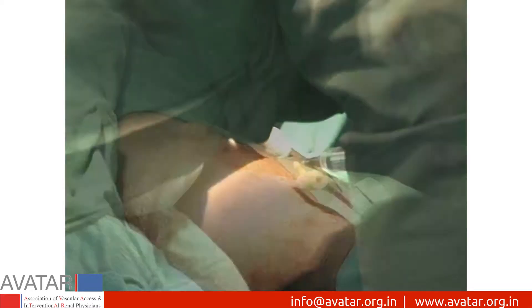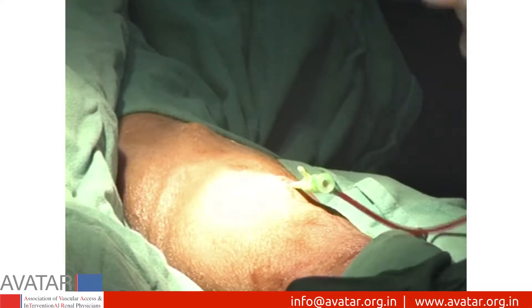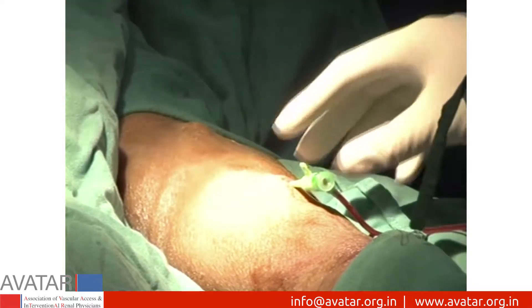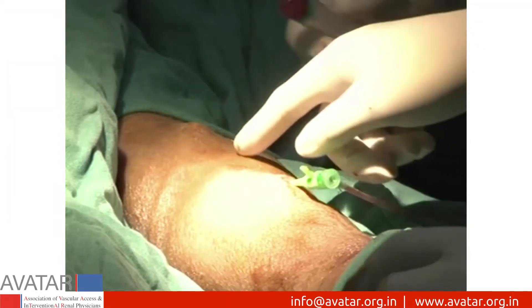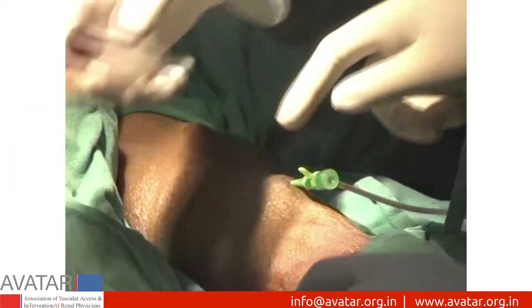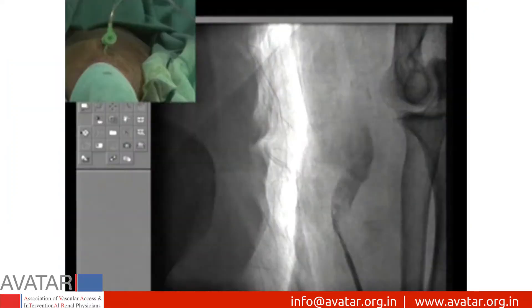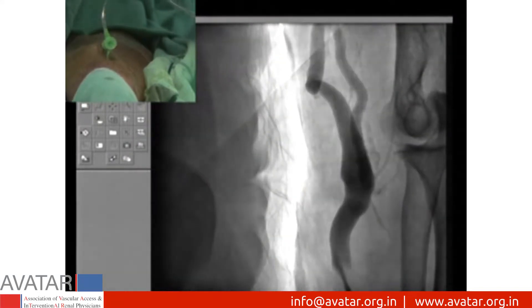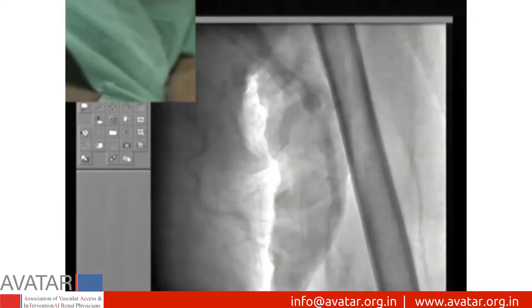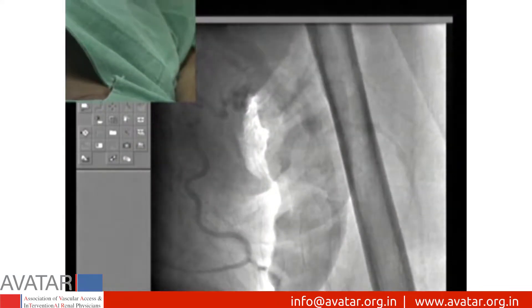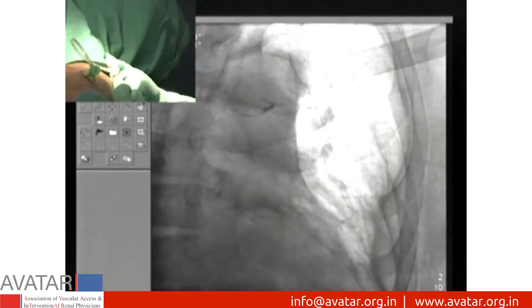The patient is cleaned and draped, local anesthesia is instilled, and a 5 French sheath is inserted into the draining vein of the AV fistula with Seldinger technique. Contrast instilled confirms the stenosis of the left brachiocephalic vein on fluoroscopy.